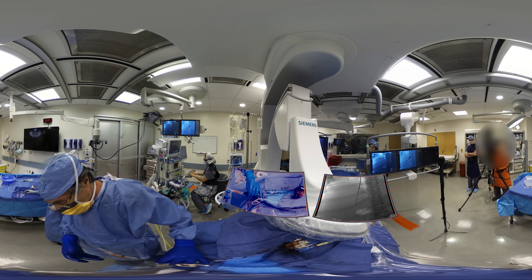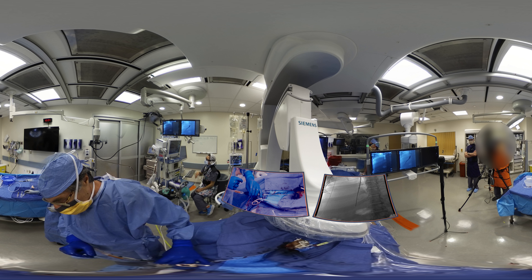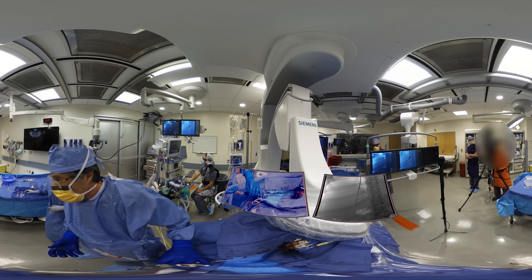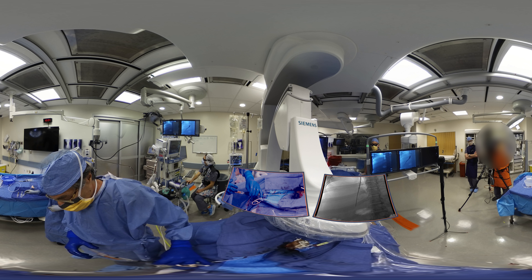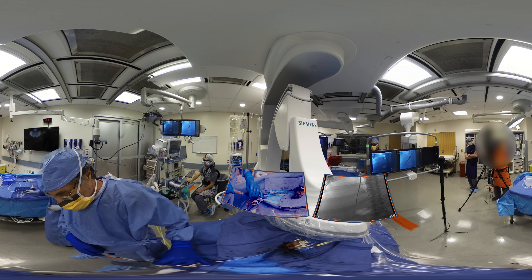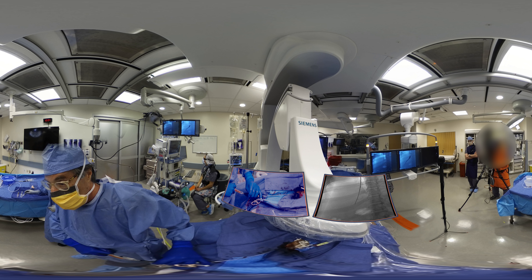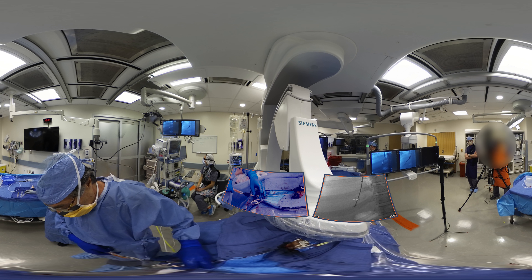The entire thing is now controlled, nothing has moved, and I can free my hand to simply aspirate. There are occasions where a core of liver may have actually been captured in the needle during the needle pass — this used to be the way that we did liver biopsy. So it's important to make sure that isn't the case; otherwise we'll be aspirating and never see blood return because there will be a plug of liver. Let's have one mag up and I'm going to try to inject the smallest dot of contrast. And indeed it felt like there was a little plug of liver — so it's good that we got that clear.